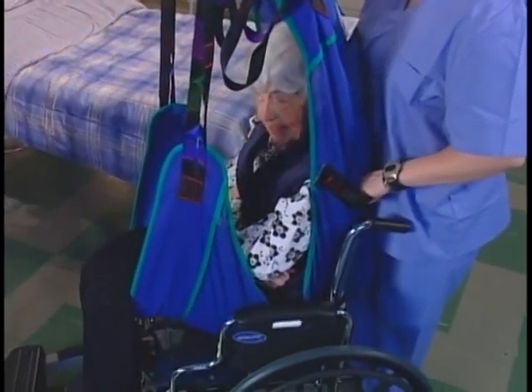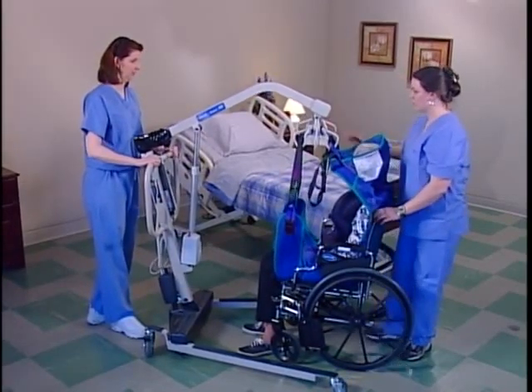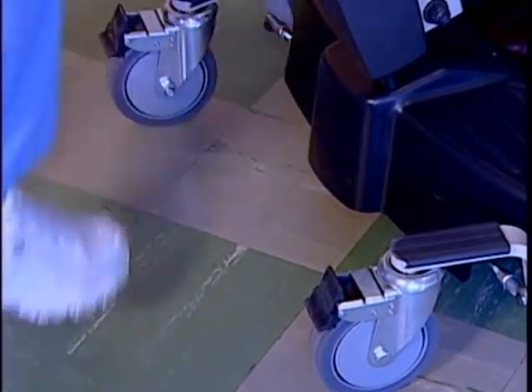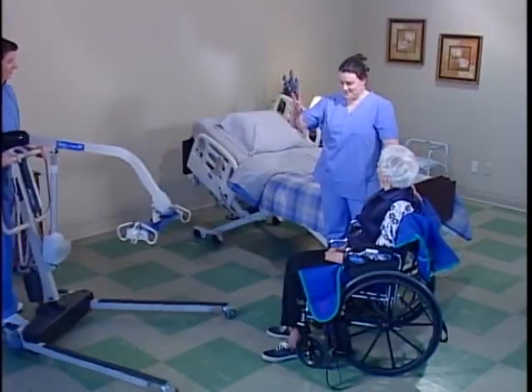Have the resident lift the leg that is closest to you so that their foot is flat on the surface. Help them if they need it. Position one hand on the resident's elevated knee and the other hand under the resident's shoulder. Simultaneously, push on the knee and lightly lift their shoulder.